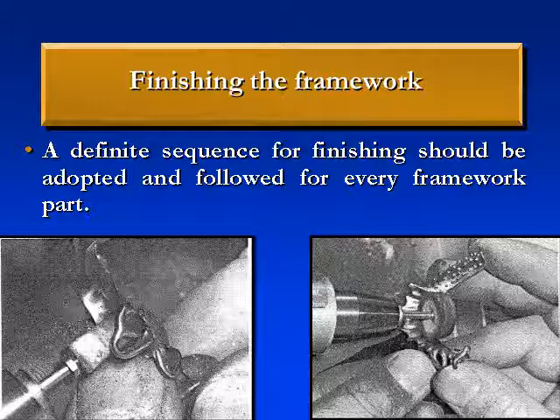A definite sequence of the finishing procedure should be adopted and followed for every part of the metal framework: major connector, minor connector, clasp tips, and denture base layer.